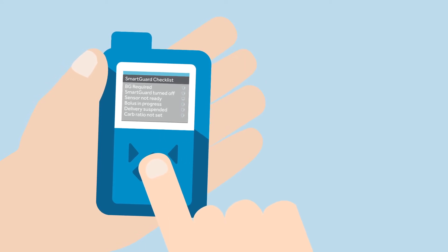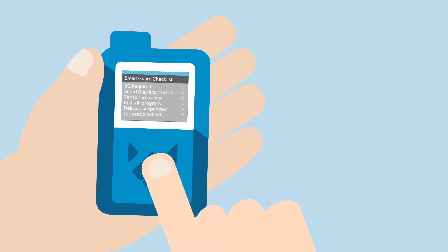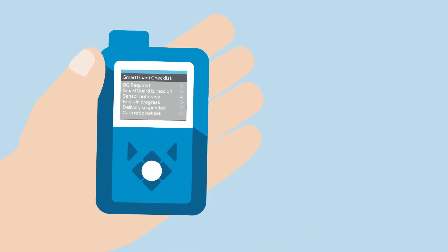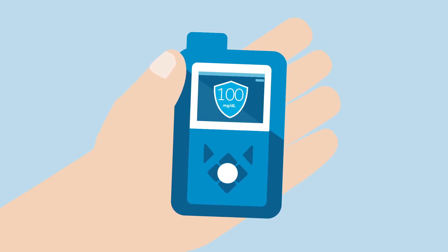The green check mark icon means that the item is ready. A question mark icon means that there is an action to be done. A wait icon means the pump is updating and there is no action to take at that time. Now the SmartGuard feature is activated and it is working based upon the SG readings. There will be a big blue shield icon with a glucose value in the middle displayed on the pump screen.